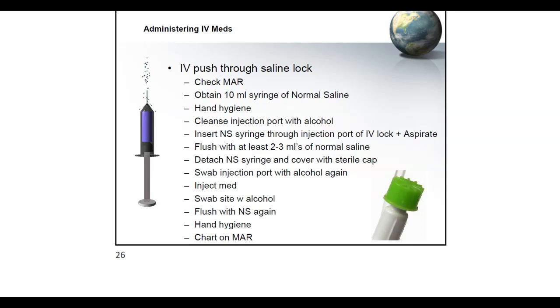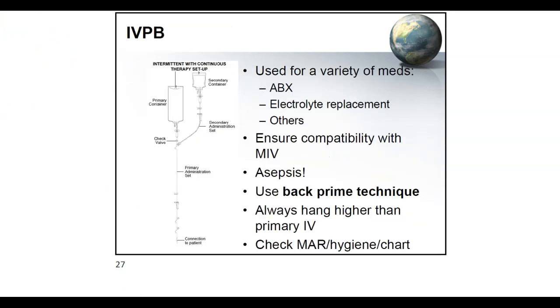So again, depending on your drug handbook or your resource, if it says 1 minute, push it in 1 minute, time yourself, and then after that you need to flush it with normal saline, and then you don't slam that, right? You need to flush it at the same rate as your medication. After that, hand hygiene, chart on the MAR, and again, go back and reassess your patient. Depending on what drug it is, then you may need to go there within 30 minutes, maybe an hour, again, depending on your patient and the drug that you gave.